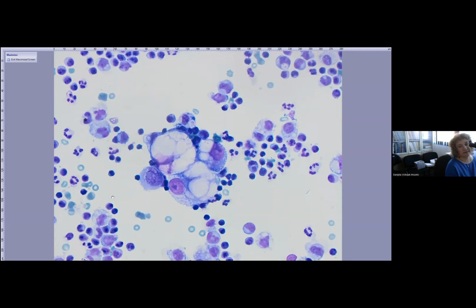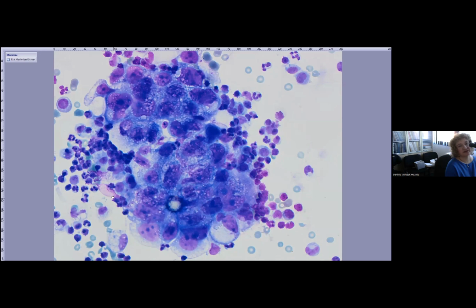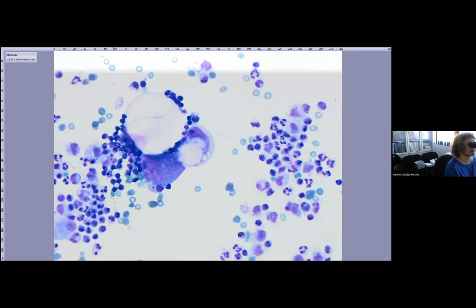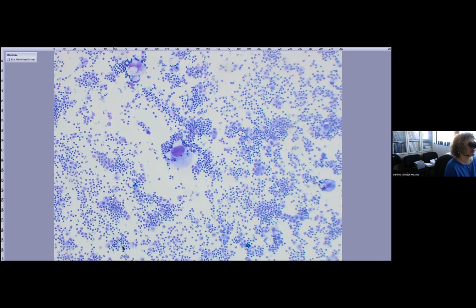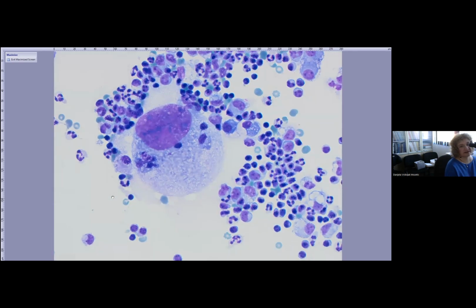Here another group. Or there's adenoformation, large nucleoli. So this is not a problem to make an intraoperative diagnosis of malignancy if you need to, but this wasn't our task here. We wanted to find out what is the origin of these cells. You can see here a really big malignant cell.